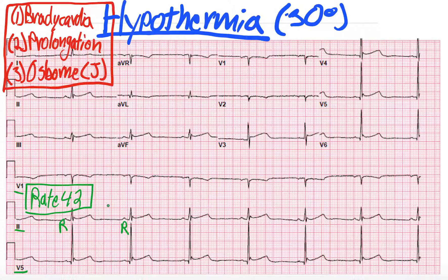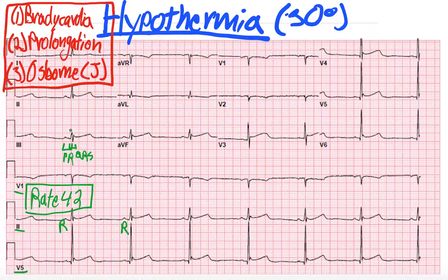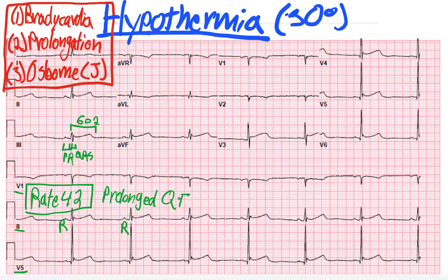The second thing we looked at was prolongation. We have PR, QRS, and QT. We have a 5-minute EKG video on calculating different intervals and segments — I'll link it in the top right corner if you have more questions. For the sake of this presentation, the PR interval is 174 milliseconds — normal. Our QRS is 96 milliseconds and normal. And then our QT, if you count the number of small boxes, it comes out to 602 milliseconds. So we have a prolonged QT, which is consistent with this patient's hypothermia.